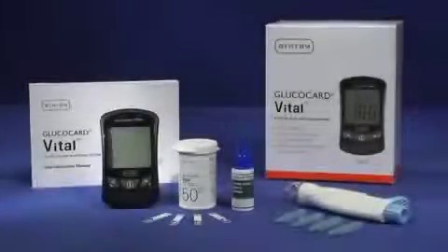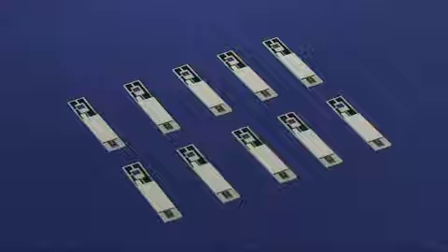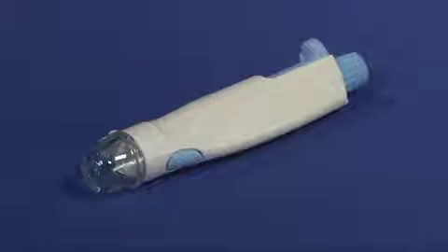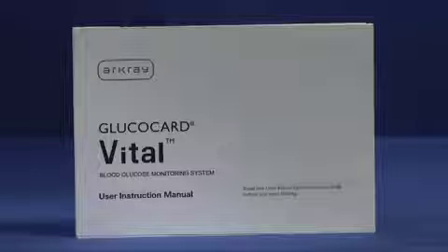Your Glucocard Vital System includes a meter with one 3-volt lithium battery already installed, 10 Glucocard Vital Test Strips, a sure dose control solution, a lancing device, 10 lancets, a carrying case, a logbook, and a user instruction manual.